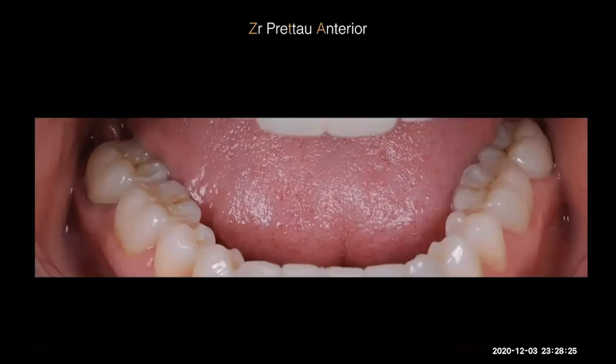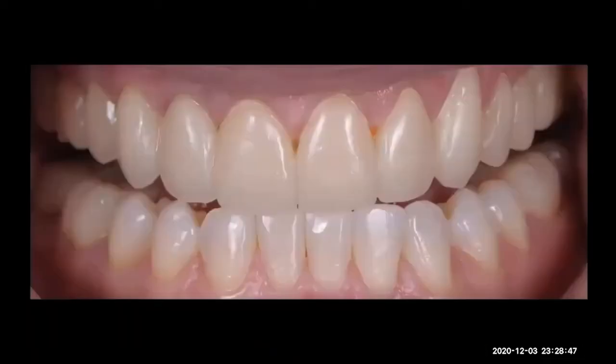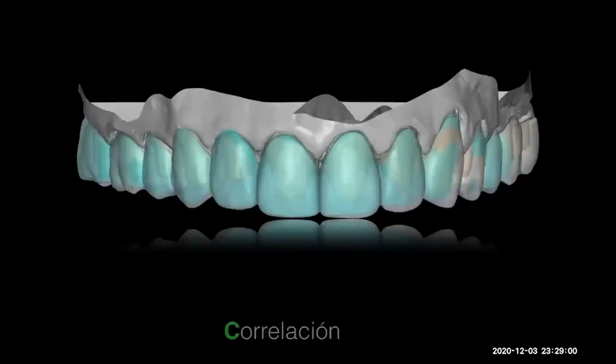We did zirconia crowns, stain and glaze, that, like I said before, I think is enough material to make nice and good restorations. And then once we cement the lower crowns, we go to the upper arch and start developing our final restoration. We place our PMMA. Then the doctor reprepped and took the intraoral impression with the iTero scanner. You see, everything works from the same design.